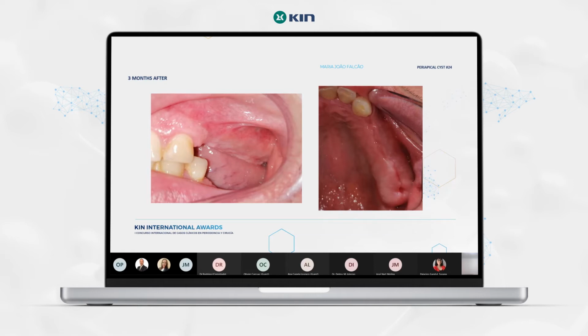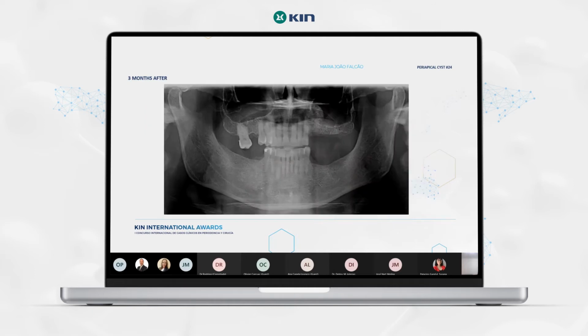And after 3 months, we saw the patient again, and this is the healing. We don't have the scar in the 23, and we have a small scar yet in the area where we extracted the tooth. That's normal. We will still have to wait a little bit more for the healing, but it has a very good aspect. And we performed a new X-ray.